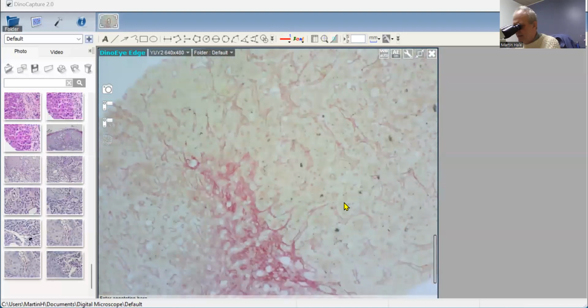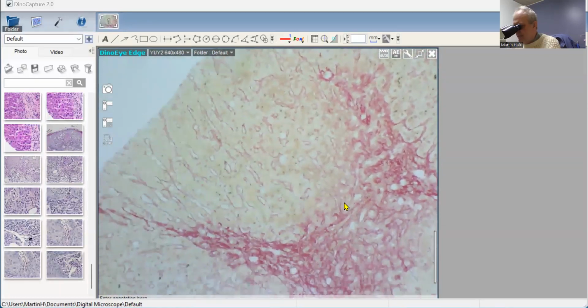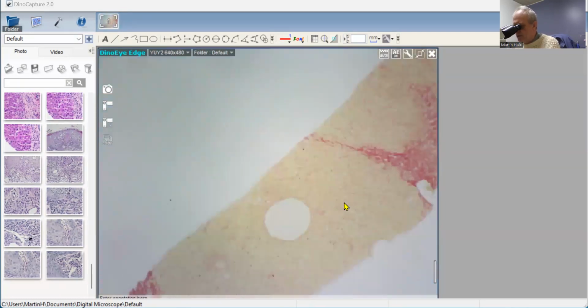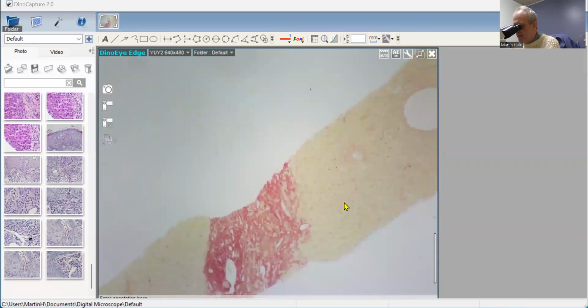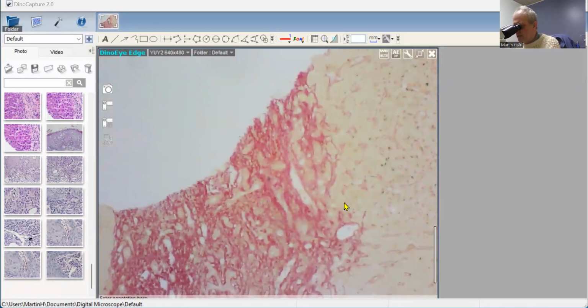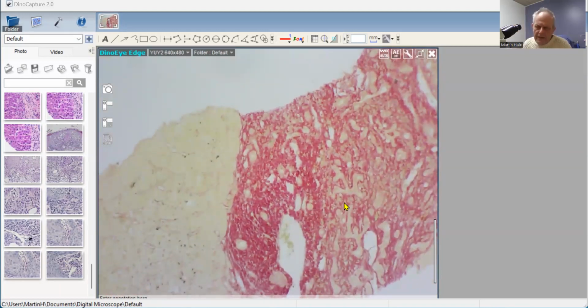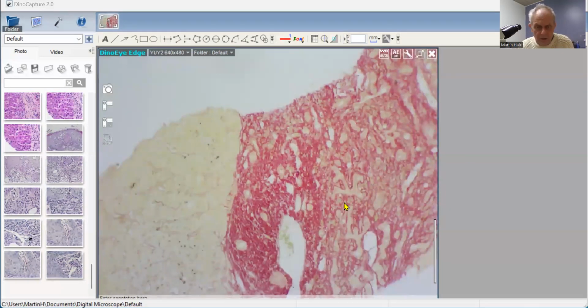So I put it to you that what we're seeing here is autoimmune hepatitis together with superimposed common bile duct obstruction secondary to chronic pancreatitis. And I think the comparison in the two biopsies is interesting because both biopsies show plasma cells, both biopsies show neutrophils, but the etiology of the neutrophil infiltrate is different, and that really is sorted out, interestingly enough, on one stain, and that's the Sirius red stain.